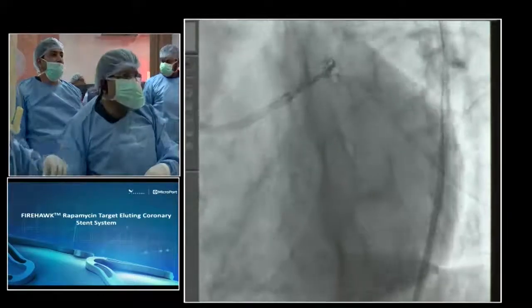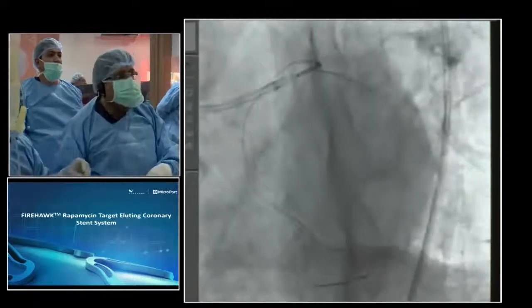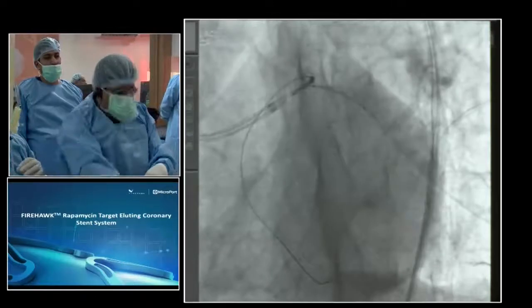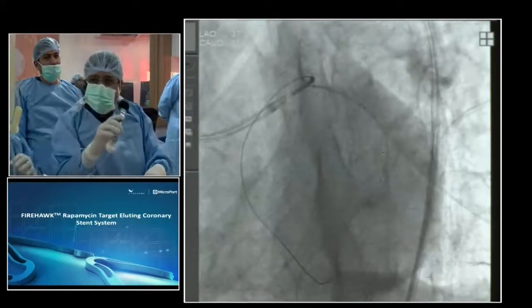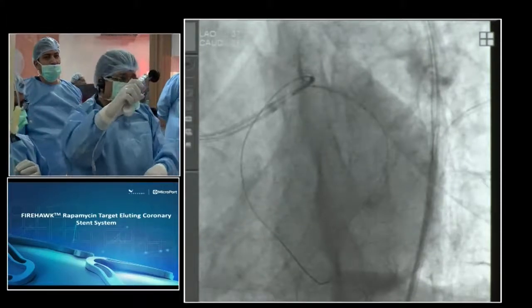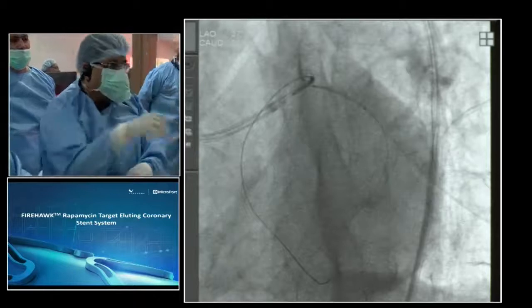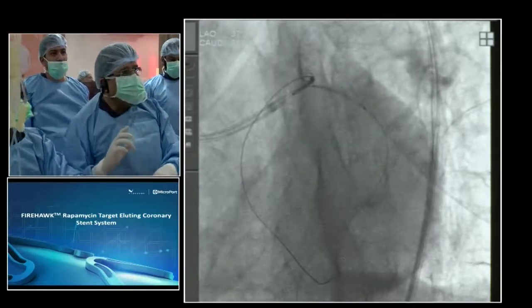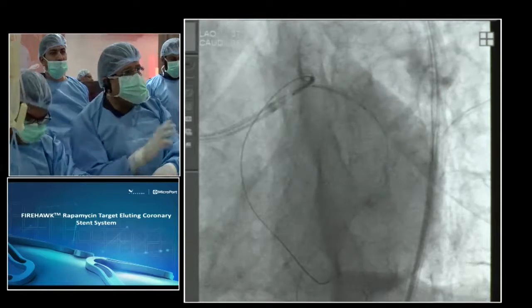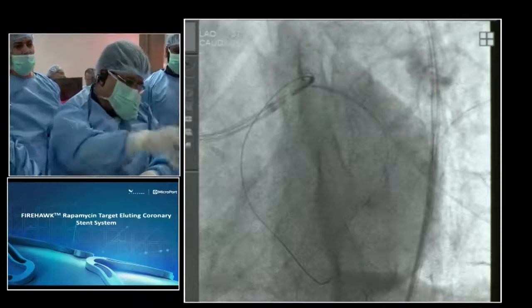So in such a situation it is always good to have the LAD stent a little distally, because you can run into trouble. For the stent which you want to deploy later on, I always say either you do not connect the inflation device or you keep the inflation device away, so that there is no room for error. Even by the slightest of mistakes, you could inflate the left main LAD stent first. So you either don't connect this or just keep it away.